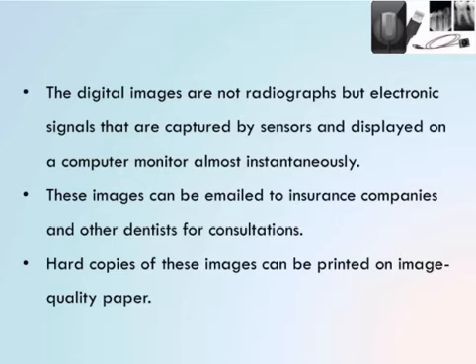As you have been using the exposures in the labs and in the clinics as well, you'll know that as soon as you do the exposure, immediately you see the image on the screen. These images can be emailed to insurance companies or other dentists for consultation as per the requirement.